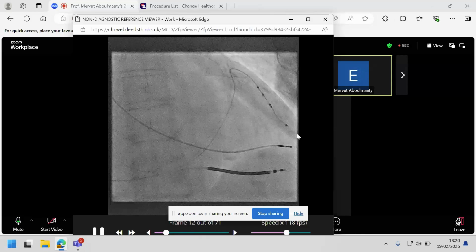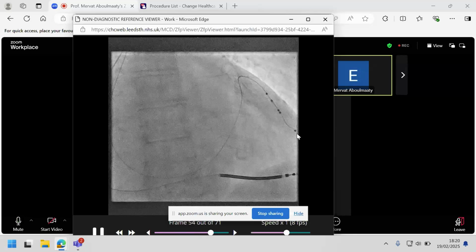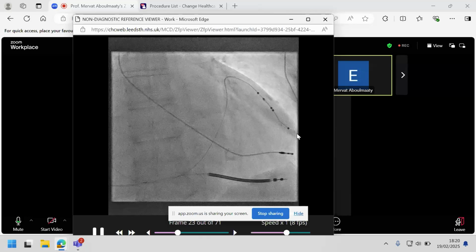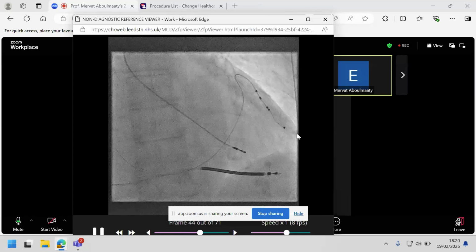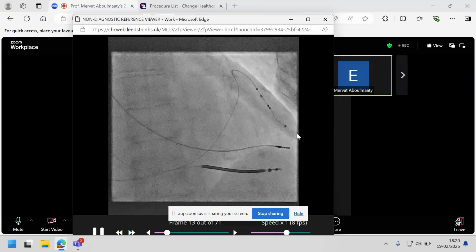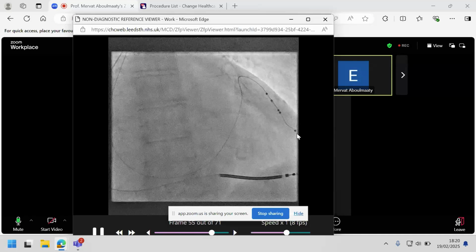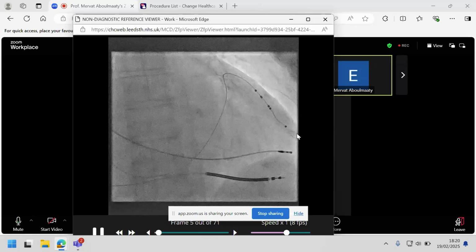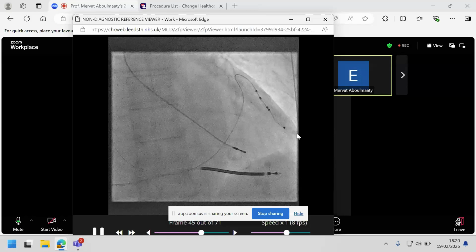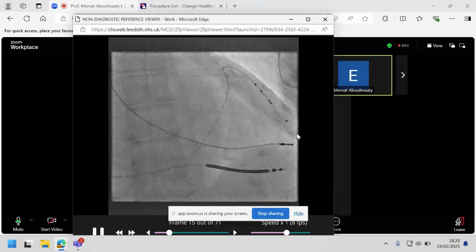And on the final point, you mentioned dissection. For those of you who are starting in coronary sinus cannulation, just remember to treat the coronary sinus with a little bit of care and respect. Pushing in sheaths, forcefully pushing in wires can disrupt the CS. In fact, my usual practice is to aspirate before I inject into the coronary sinus, because if you are jammed in between the vessel and you then inject contrast, all you'll see is a dissection. So just bear in mind that when you think there's a valve, approach with care.